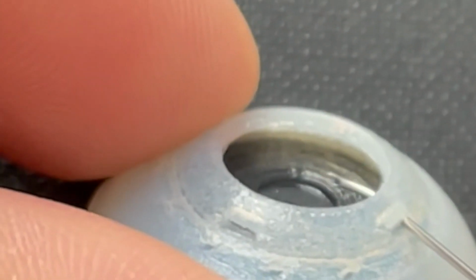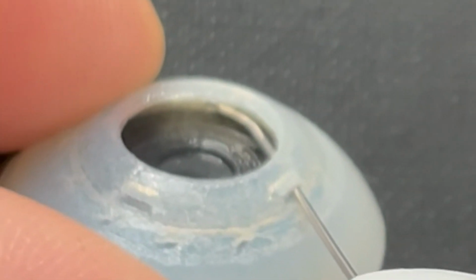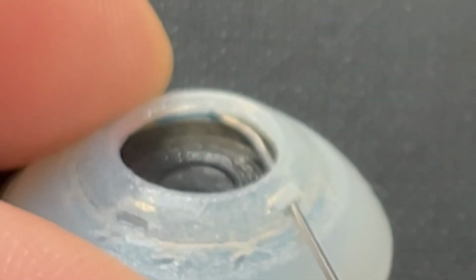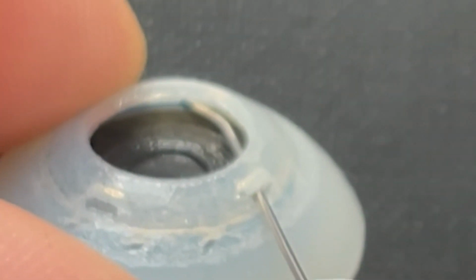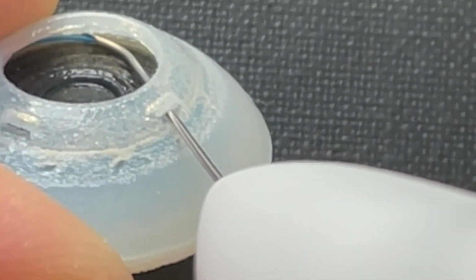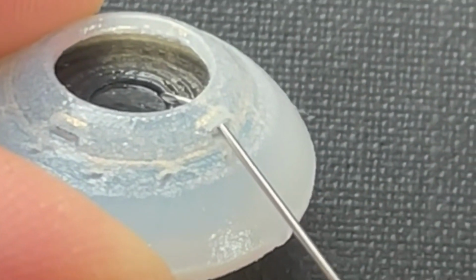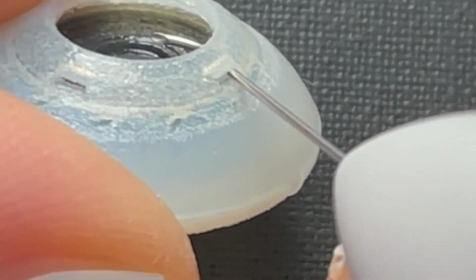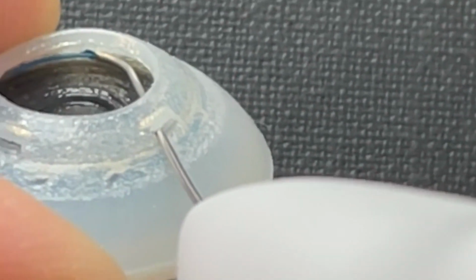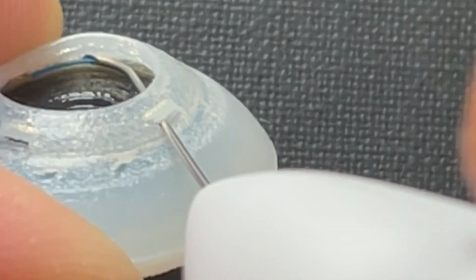Here we have the Simuli demonstration that shows the Omni surgical system cannula advancing across into the eye and then piercing the trabecular meshwork. And I will show it here twice so that you can get a good idea of how it works. Again, the cannula is advanced through the clear corneal incision, across the pupil, where it pierces the trabecular meshwork, and then it is aimed anteriorly towards the corneal endothelium to allow the microcatheter to go easily and smoothly into Schlemm's canal.